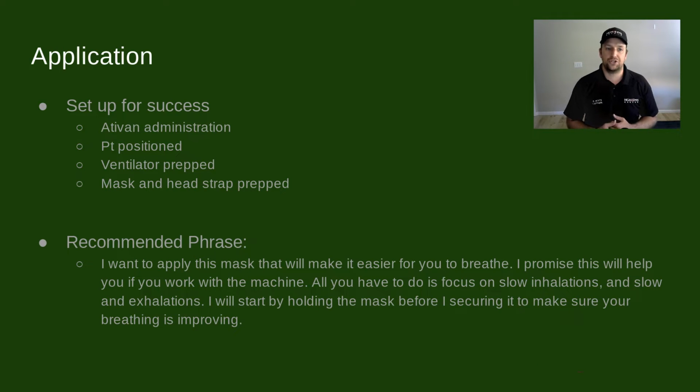For BiPAP application, as with all things, the key to success is setup. First, I think giving somebody 0.5 to 1 of Ativan while you're getting everything out and set up will greatly increase your chance of patient-ventilator synchrony, or working together, which will actually help improve the breathing. Next, get the patient positioned. You want them to be in high Fowler's or just slightly semi-Fowler's. This will give you the best position to get the weight off the chest for good inhalation and good exhalation.